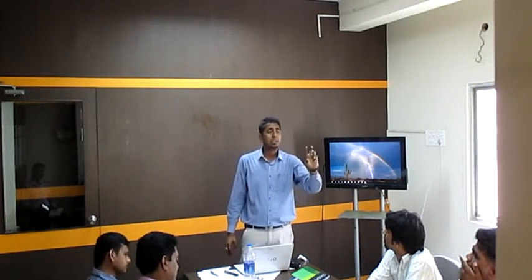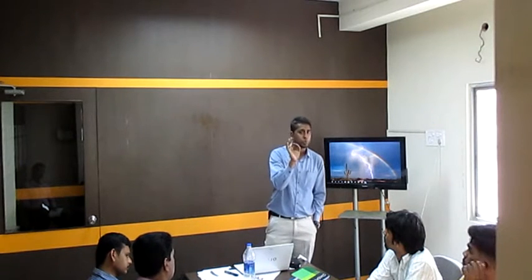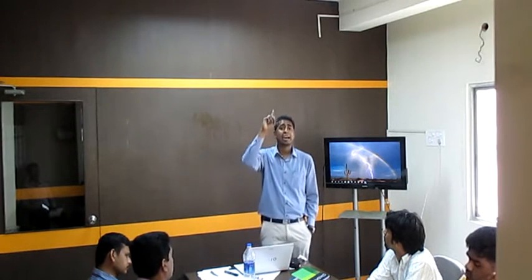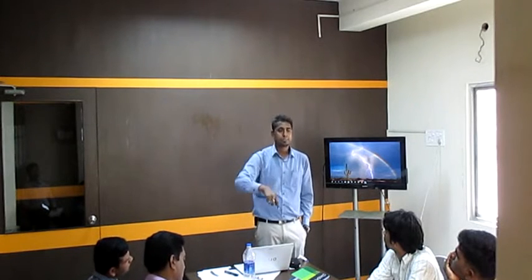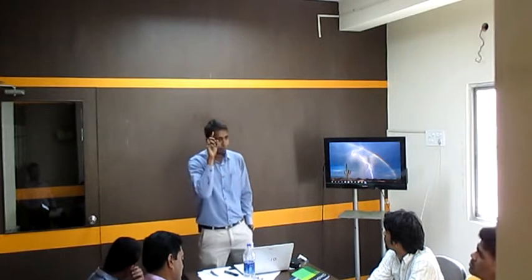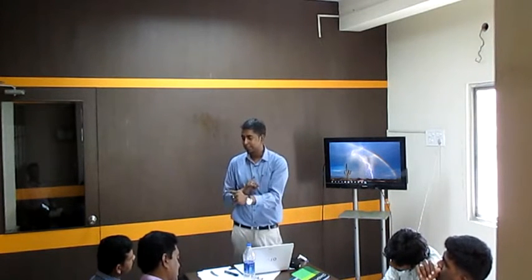Now, how this relation plays a vital role. Just keep in your mind, for cutting of hard tissue, you require high speed, less torque. For soft tissues, high torque, less speed. Always keep this relationship in your mind. For hard tissues, high speed, less torque. For soft tissue, high torque, less speed.